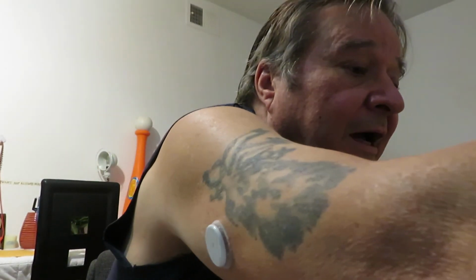I hope you see how easy that is. And like I said, they're great for the shower. You don't have to worry about it. Now, you want to make sure you know it's there so you don't go scrubbing. But I've accidentally hit it and went, oops, and then cleaned around it. Now it's on this side, so now I just have to get used to it being on this side. But that's okay. That's fine. A lot better than the old finger pricking package.